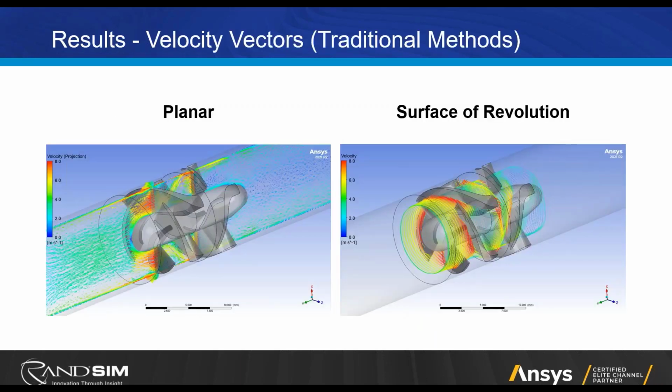It keeps track of everything for you there, but okay, good. Next slide. So let's look at some results. This is the fun part of the analysis, I guess, looking at what the solver has told you. So traditional views are like these. What you see on the left is just a slice plane, a 2D plane through the model, and we're just looking at velocity vectors on that surface. And in general, that is okay, but you can see when it cuts through the blades at arbitrary points, it makes it difficult to kind of see what's going on, right? So this isn't the best way to analyze a turbo machine.